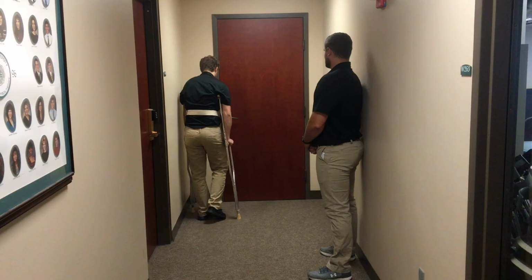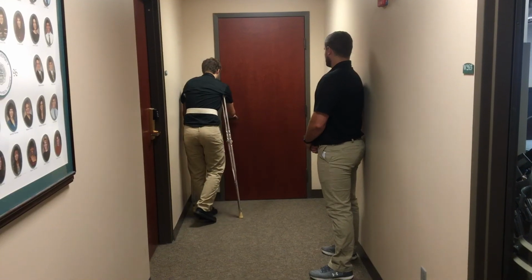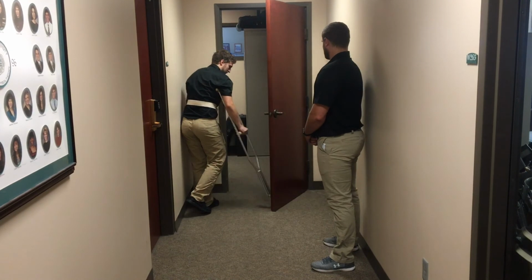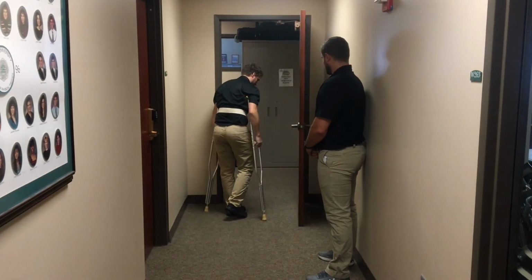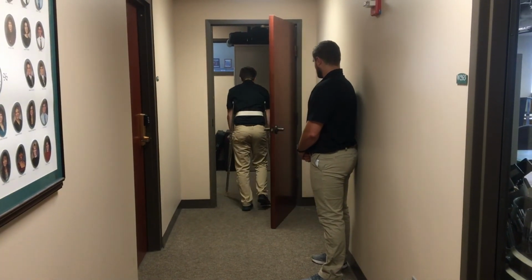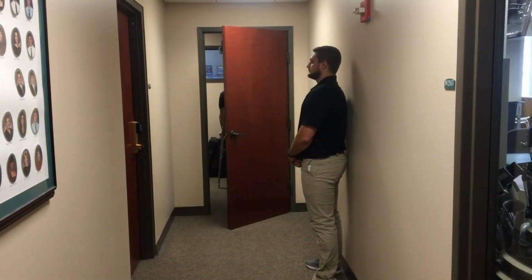Instruct the patient to approach the handle side of the door as before, outside of the swing arc of the door. The patient will shift their weight to the crutch opposite of the hand that will open the door. The patient will place their free hand on the door handle and swing the door wider than the patient and the crutches. The patient will then use the crutch closest to the door as a doorstop again. Another push may be needed to adjust the doorstop closer to the hinge side of the door as the patient traverses through the door in a straightforward fashion.